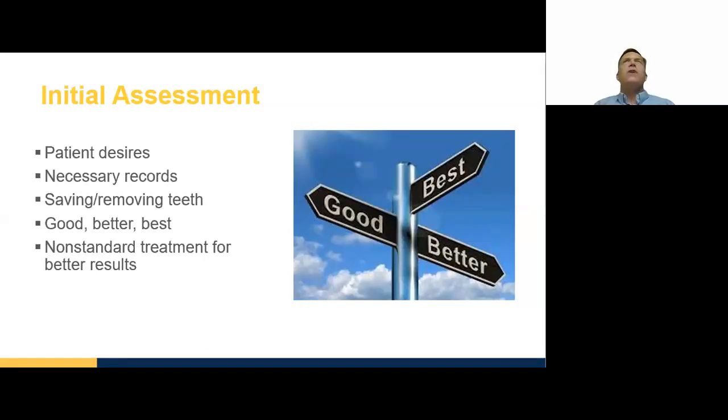And in terms of setting up your gingival height, the gingival height of the other 3 teeth on the prosthetic is going to be determined by number 9. So in that situation, and again, in discussion with the patient, you may decide that you extract number 9 so that you get a much better result for the patient.